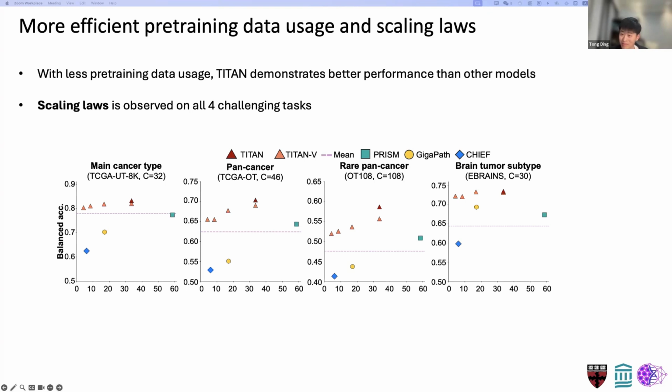It's mostly for fine-tuning. So here our effort is mainly about producing a model that can produce off-the-shelf usable slide features for various downstream tasks.